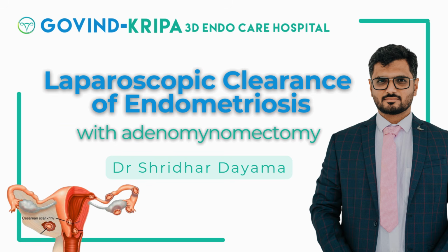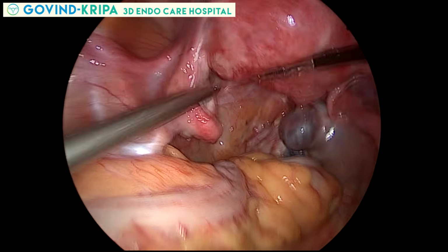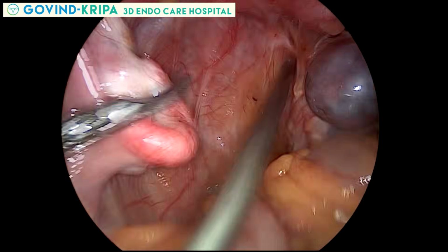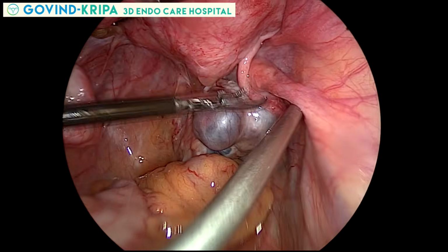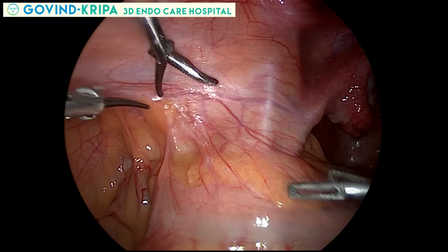This is laparoscopic surgery for clearance of endometriosis along with adenomyomectomy to enhance the fertility. As you can see, the right ovary is adherent in the ovarian fossa and to the rectum, and there is a disturbance in the tubo-ovarian relationship.